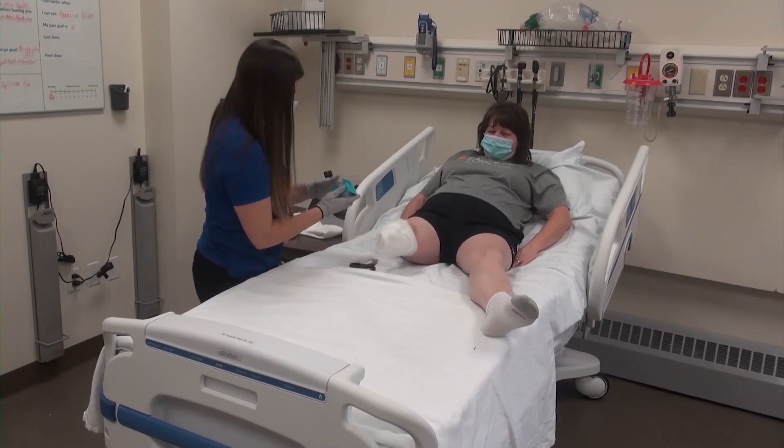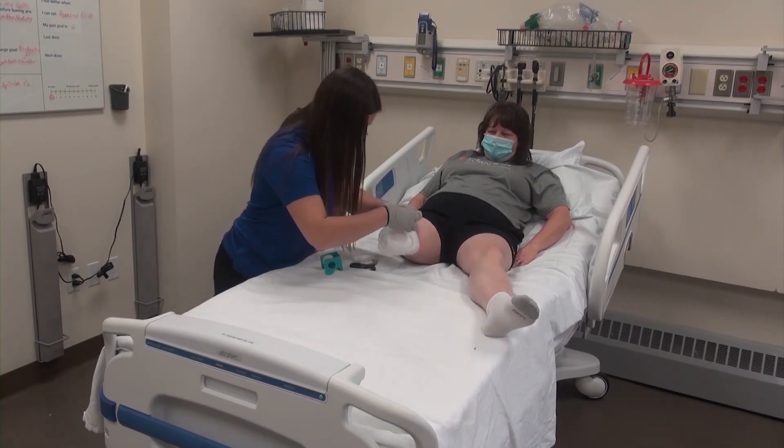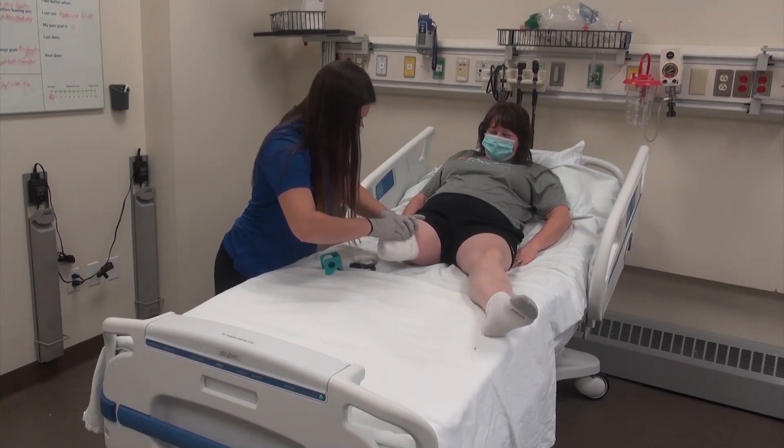This can be secured with surgical tape once the leg is covered just distal to the patella. Once this is complete, the process of applying the shrinker, prosthetic sock, and rigid removable dressing begins.